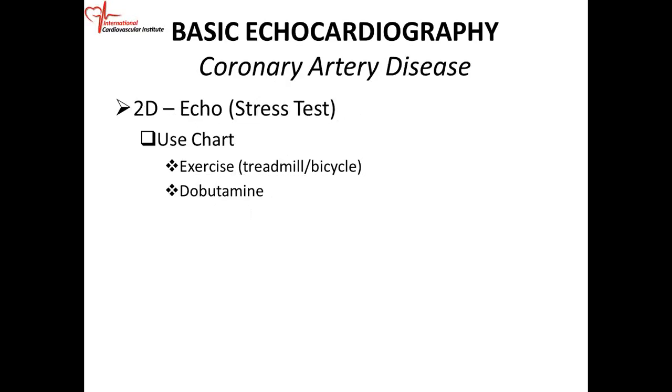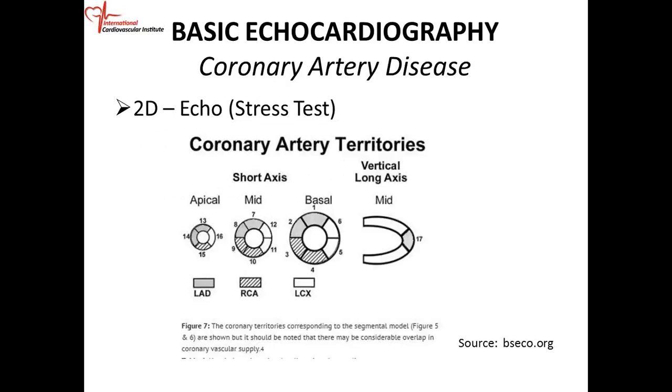Okay. Most of what we do is a treadmill stress echo. You can also do dobutamine stress echo. So if the patient cannot exercise for whatever reason, or if the patient is taking medications that will affect how much they exercise, you can do the dobutamine stress echo.